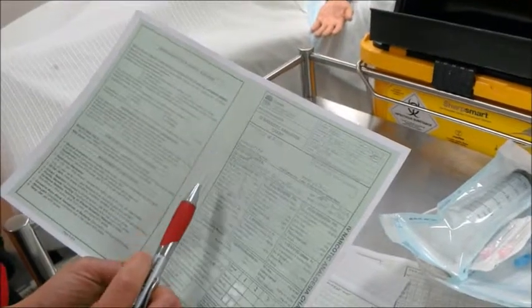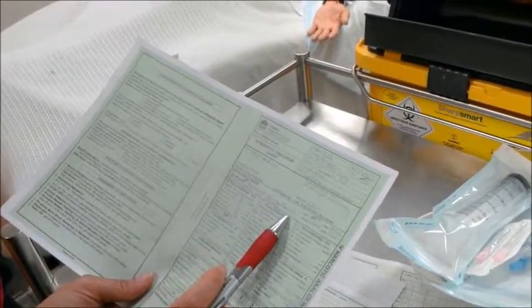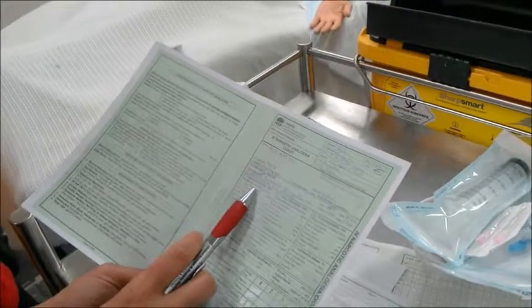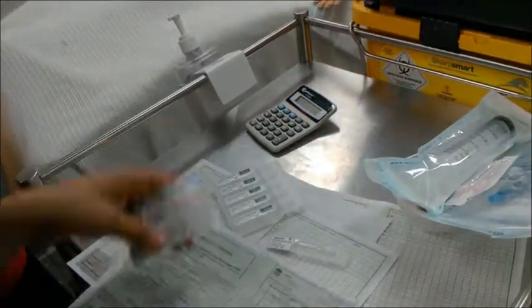It's been written here. She's been ordered for today morphine 50 mg in 50 ml. It's been signed and dated by the doctors and doctor's name under here. So 50 mg morphine in normal saline 50 ml. So I've got morphine here.